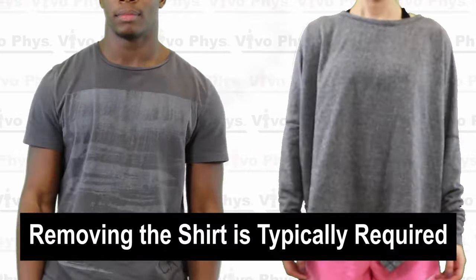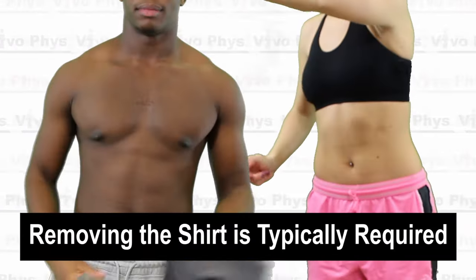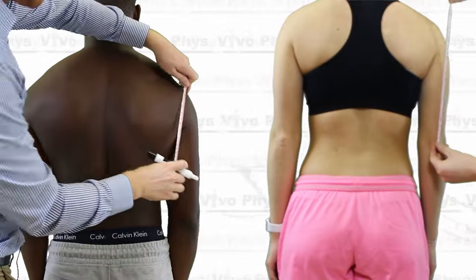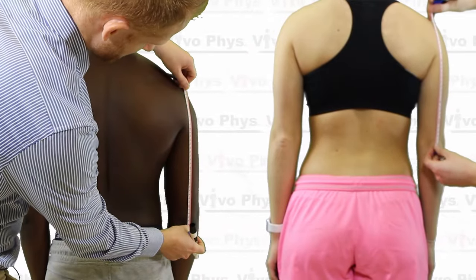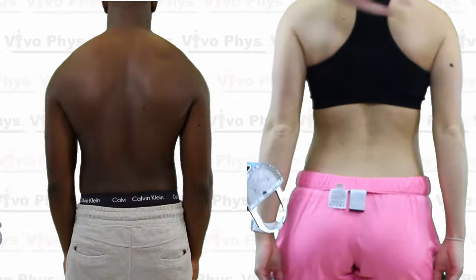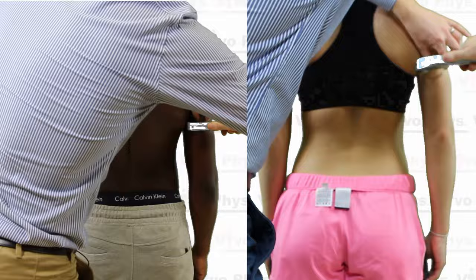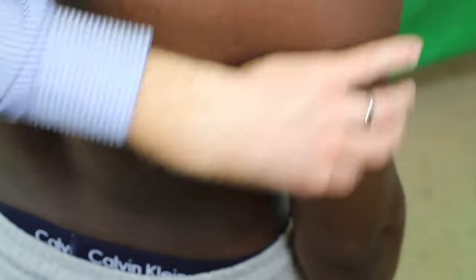In order to make sure that you do all of your measurements in the exact same spot each time when you're cycling through, we're going to put a little marker dot — assess where the location should be and then just pinch where that marker dot is every time. The triceps skin fold site is going to be halfway between the olecranon process of the elbow and the acromion process of the shoulder, on the midline on the back of the arm. This is a vertical fold.